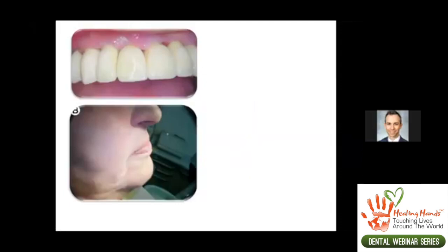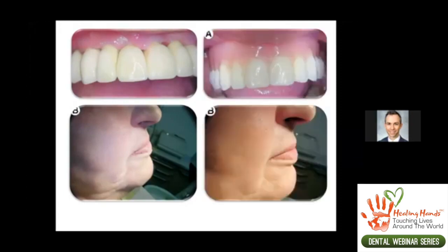Here's an example of a patient who is edentulous, and for an edentulous restoration, you've got to look at soft tissue, lip and nasal support. And for patients that need more lip or nasal support, those patients can benefit from a hybrid prosthesis or removable prosthesis that has a flange, ideally removable probably, to give them some additional support in that area and be able to remove it for hygiene and cleansability.